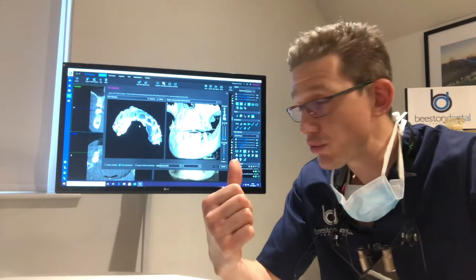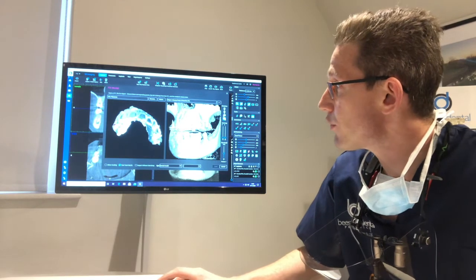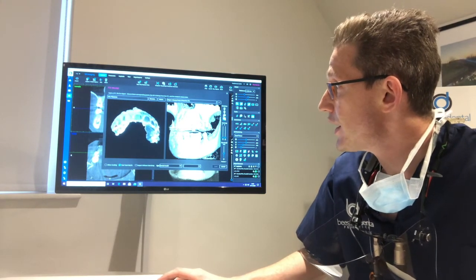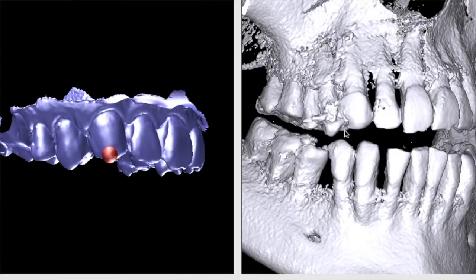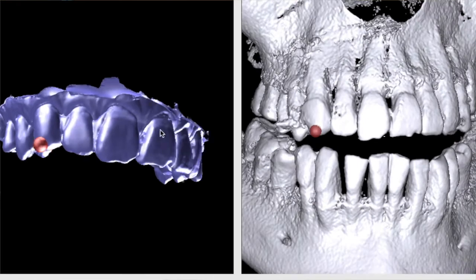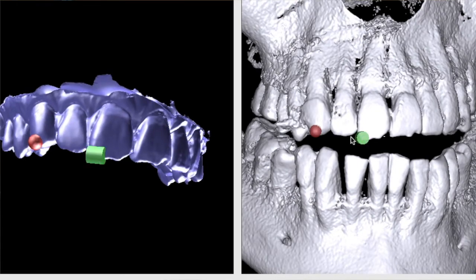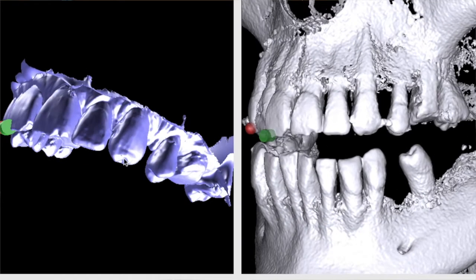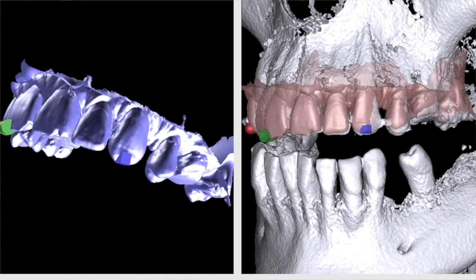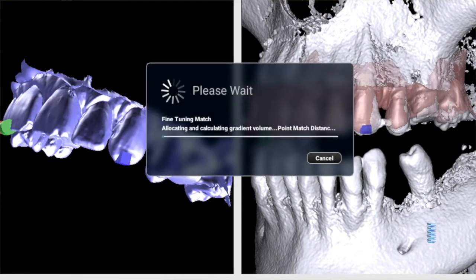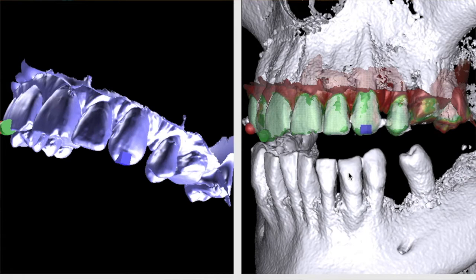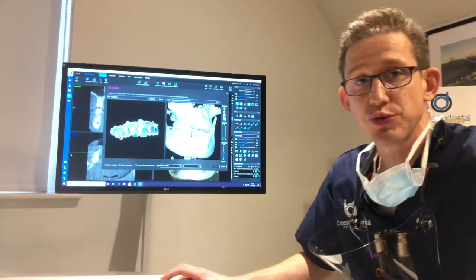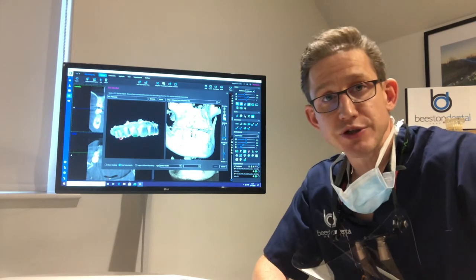So how do we do it? We use the Planmeca Remexis software. The first thing to do is to give the computer three waypoints on the intraoral scan and match them up with the waypoints on the CBCT scan, which you can see me doing here. Once we've done that, the computer will process everything and tell us that it's managed to superimpose those images together.